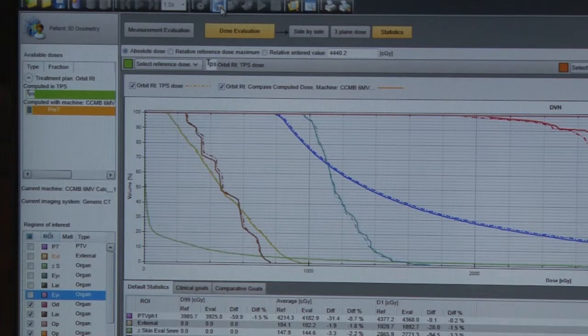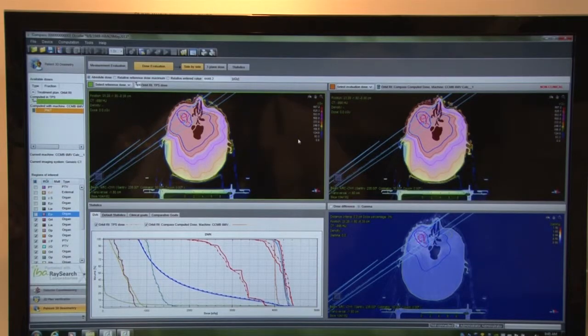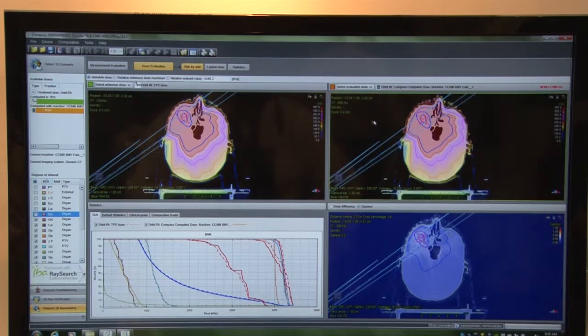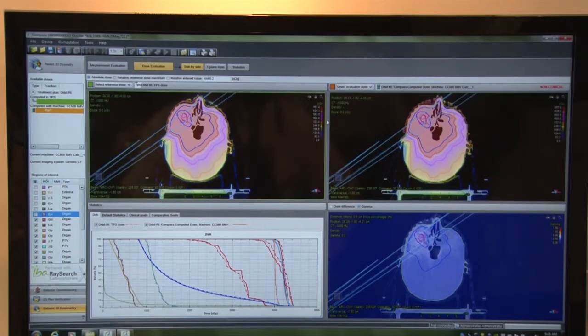So once you've evaluated your patient, you have the ability to export that plan into the SQL database that's built into Compass. One of the new features with the 3.0 release is the ability to compare the actual TPS data to a reconstructed dose or a recalculated dose. We also have the ability to take a reconstructed dose and compare it to our calculation algorithm.